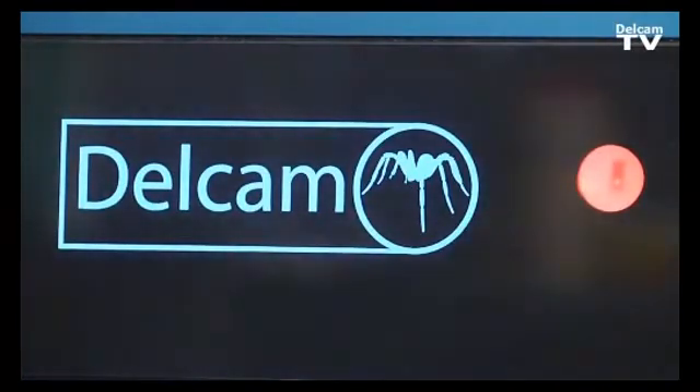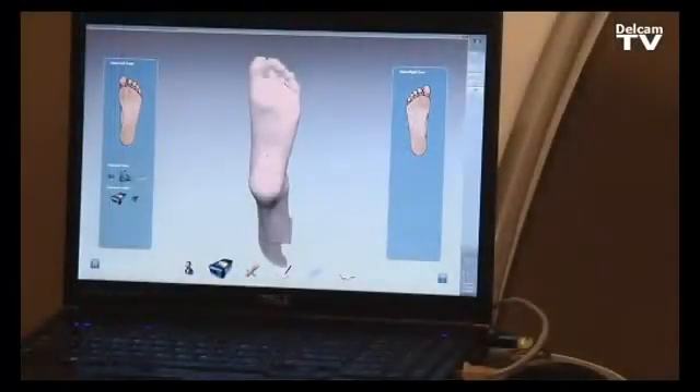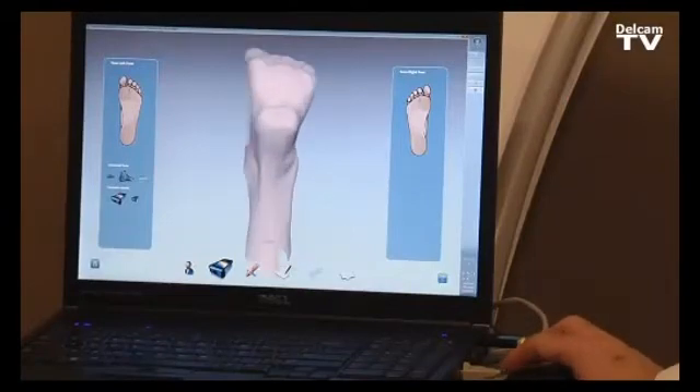The iCube scanner is going to take a 3D image of the foot and also a 2D picture of the foot to check for calluses and ulcers. Now we have the semi-weight bearing image of the patient's foot, and it's clearly possible to see the calcaneal angle and other features.